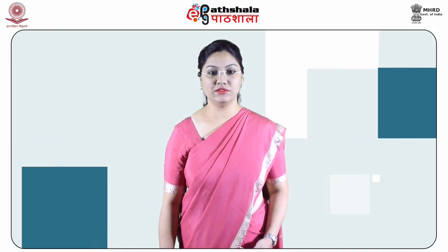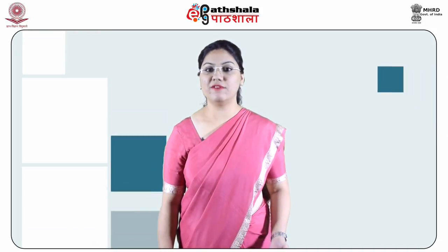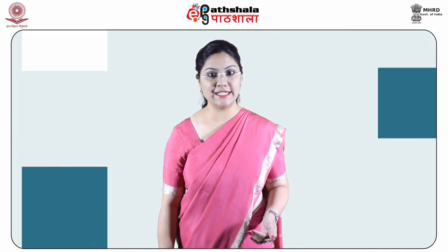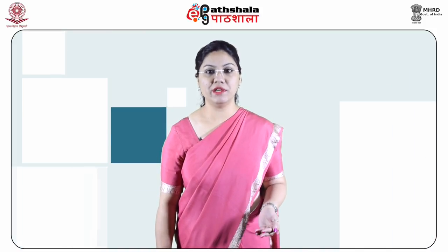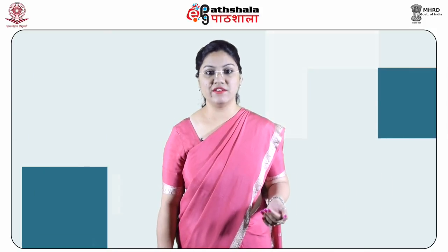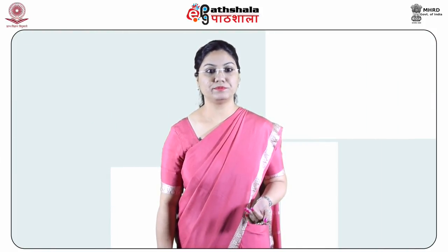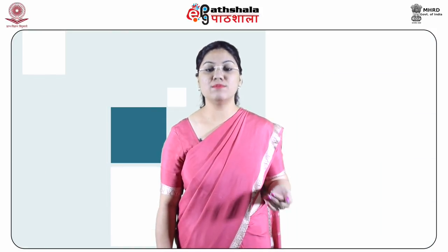Higher attenuation, the denser tissue, results in whiter pixels, and lower attenuation results in darker pixels. For example, the cranium will appear very white, while the less dense brain will appear in varying shades of gray. CAT scans are less expensive than most other techniques. The CAT images, however, have poor spatial resolution as the range of X-ray absorption is small between tissue types. It does not allow sharp differentiation between structures.